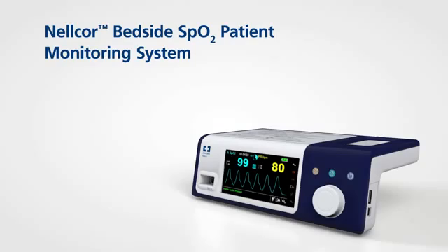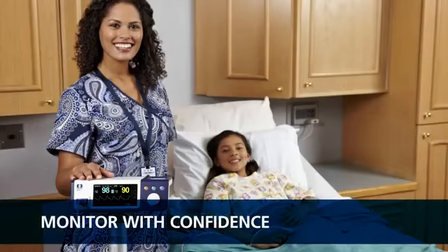With its easily accessible features and user-friendly interface, the Nellcor Bedside SpO2 patient monitoring system makes it easy to access critical patient information. Clinicians can feel confident in the ability to detect respiratory complications earlier and intervene sooner. It all adds up to better patient care.